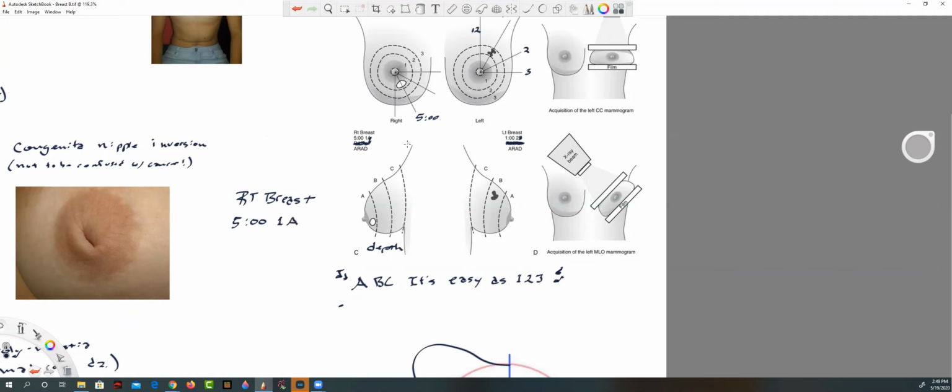And if the image is taken, yeah, see, this is the part we don't really know. The ARAD or RAD. It says ARAD. Let's go ahead and put our transducer in. Sorry guys, I just realized I kind of screwed up, but not a big deal.